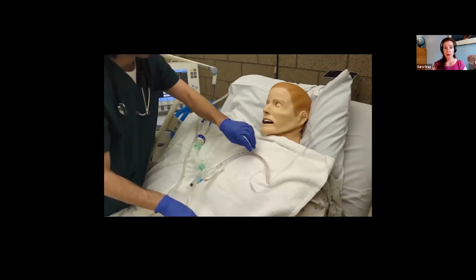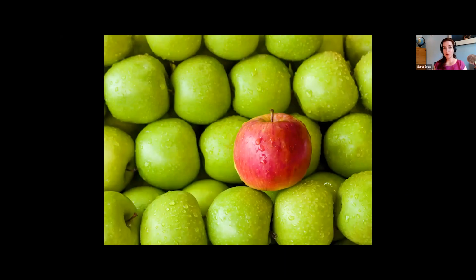The key piece here is excellent patient selection. Not all of your patients are going to be candidates for this. You want to make sure they're an easy airway and that the initial indication for intubation has reversed, that they're wide awake and obeying for you. But patients who have this are so grateful. They're so pleased to have it out.